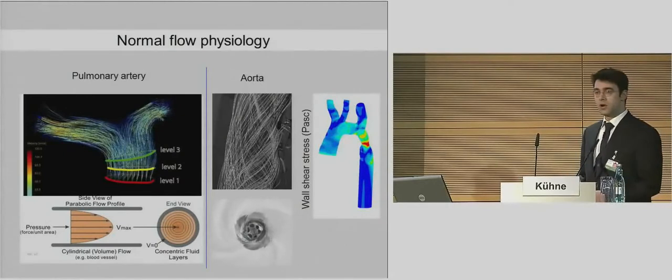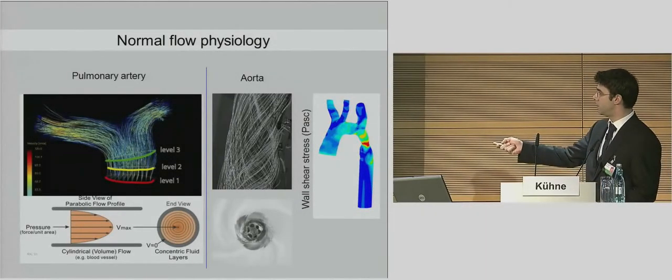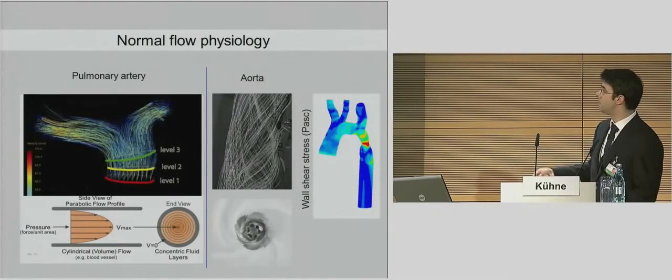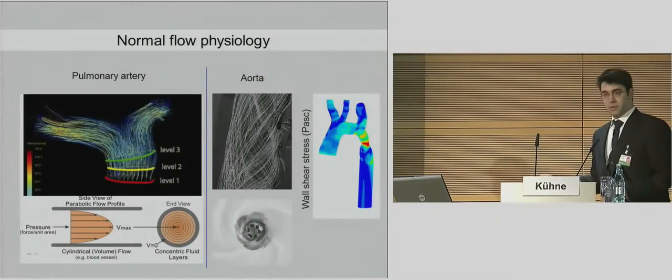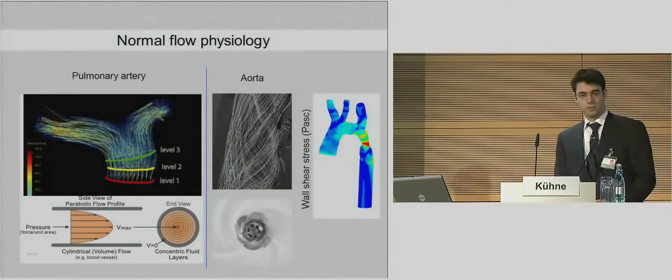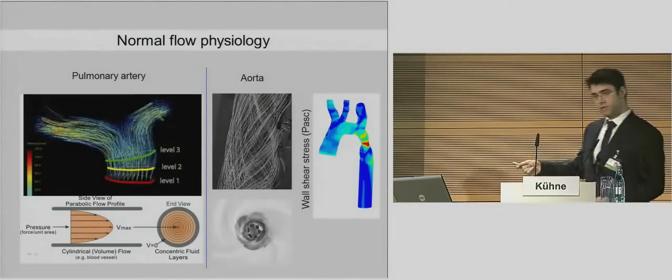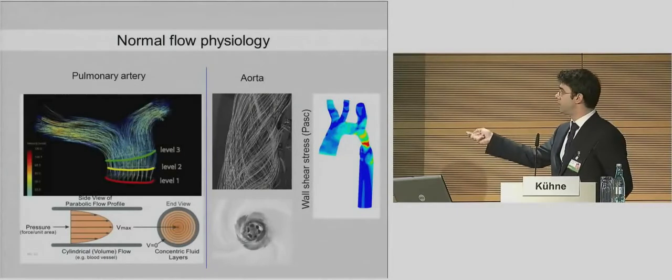So we are talking about near laminar flow. We know we never have laminar flow situations in the human, but near laminar flow. So this would be laminar flow, everything nicely lined and in circles and very clear. In the aorta, it looks different. You know this from your sink this morning. It's a swirl if you let the water go, and it's a left-turning swirl.